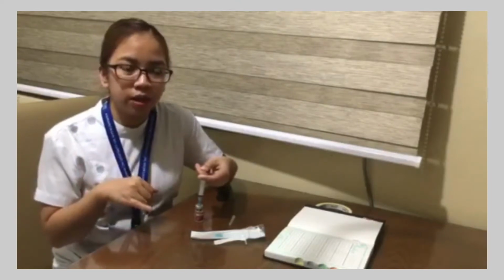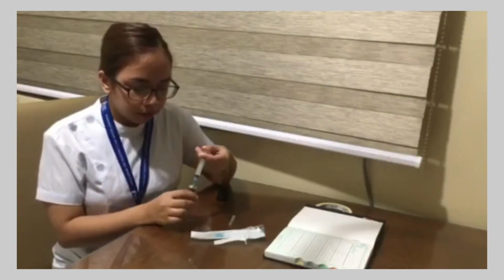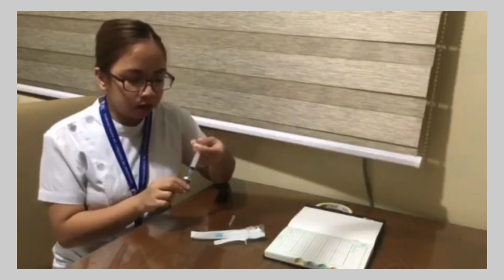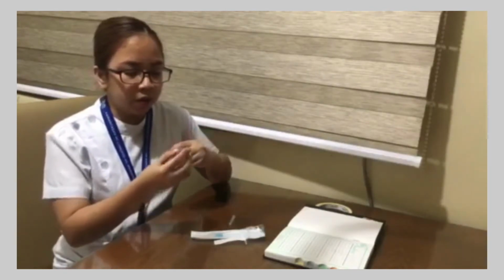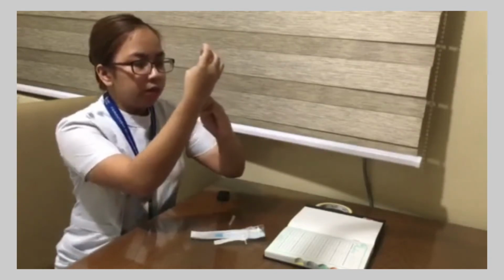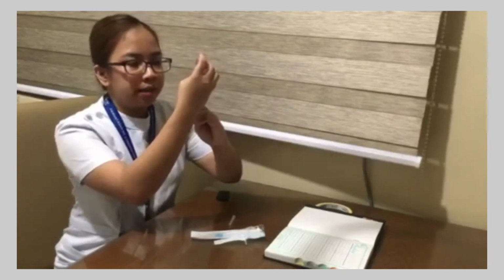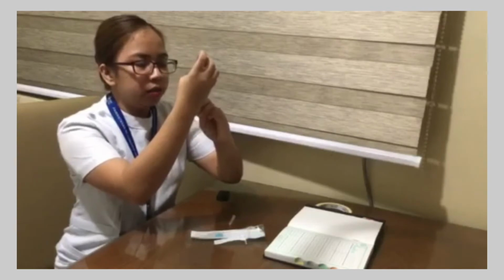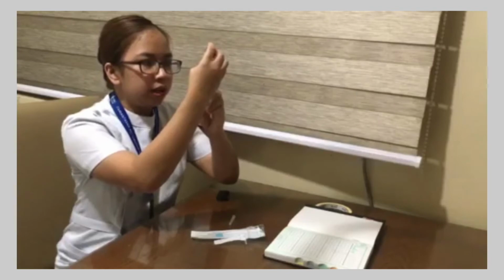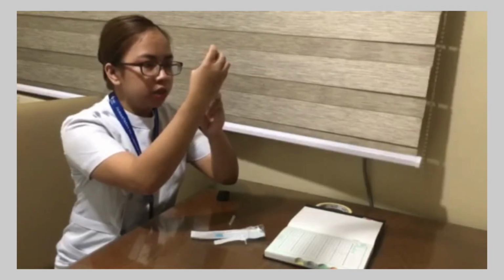There are two ways of withdrawing the medication. One is to withdraw it with the vial base down, and the other, which we're going to do here, is to place the vial inverted. I'm going to hold the vial and the syringe at eye level so I can ensure the dosage that I'm going to get, and then slightly pull to get the right amount or the right dosage.